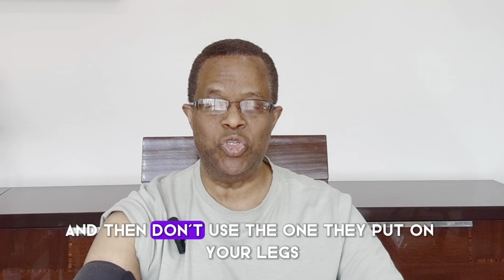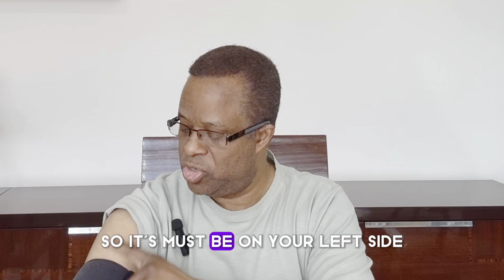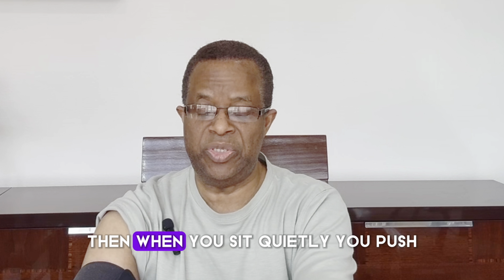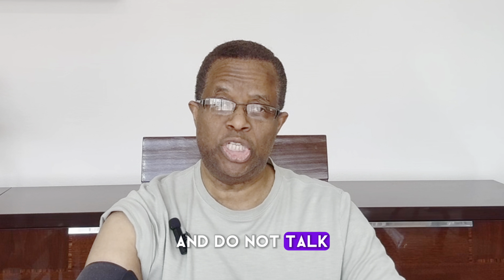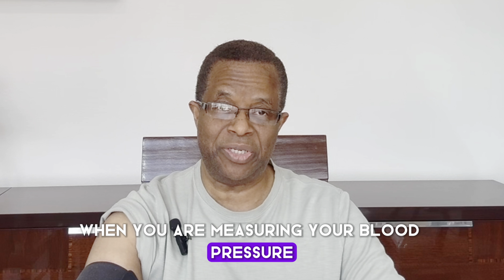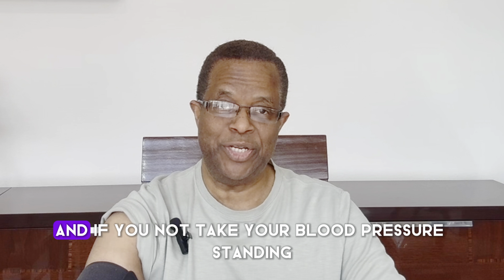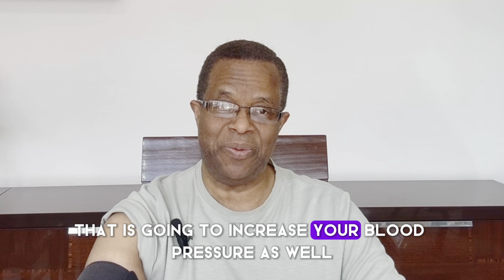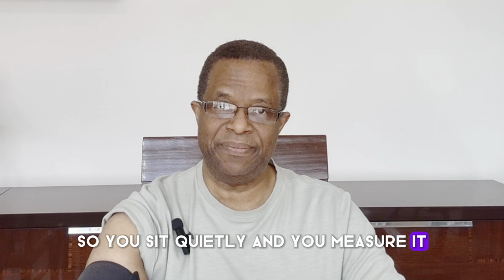And then don't use the one they put on your legs. It's not accurate either. So it must be on your left side and it must be like this. Then sit quietly. And do not talk when you're measuring your blood pressure, because that is going to increase your level as well. And you should not take your blood pressure standing. That is going to increase your blood pressure as well.